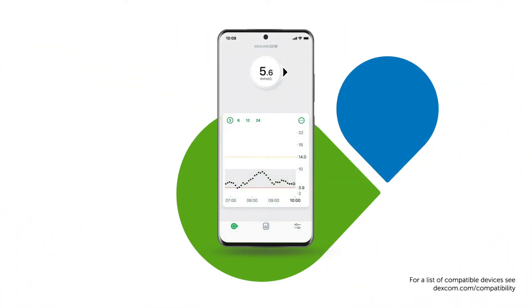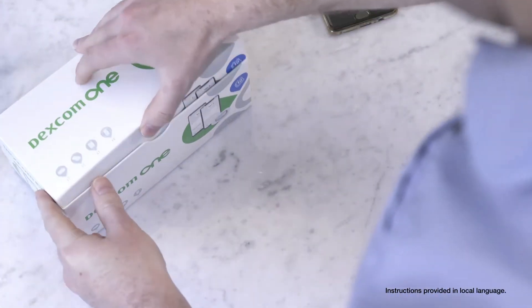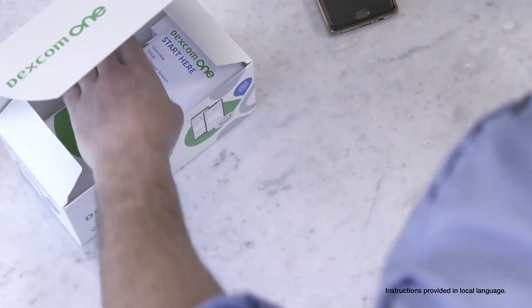Your smartphone shows where your glucose is at and which direction it is heading. You can also set up optional glucose alerts. Those are the components. Now let's show you how to get started.